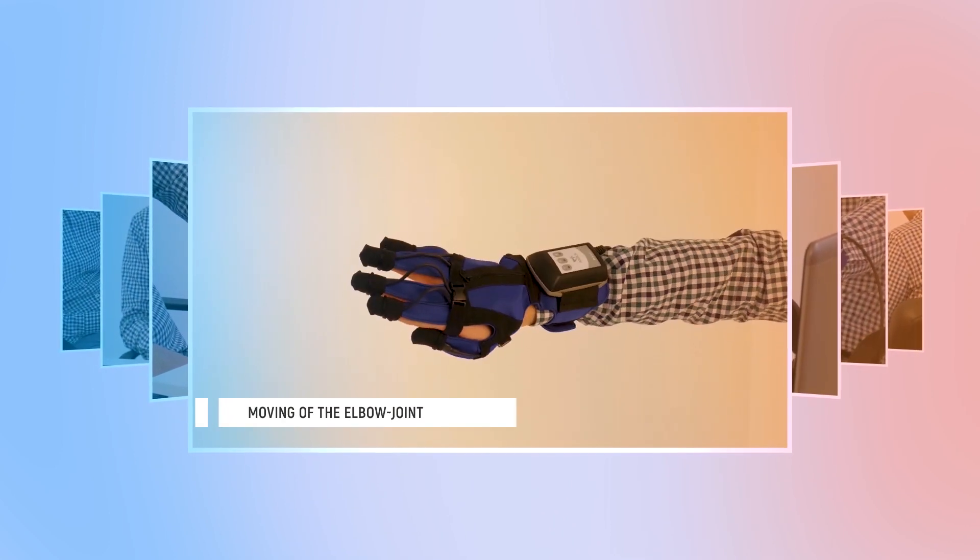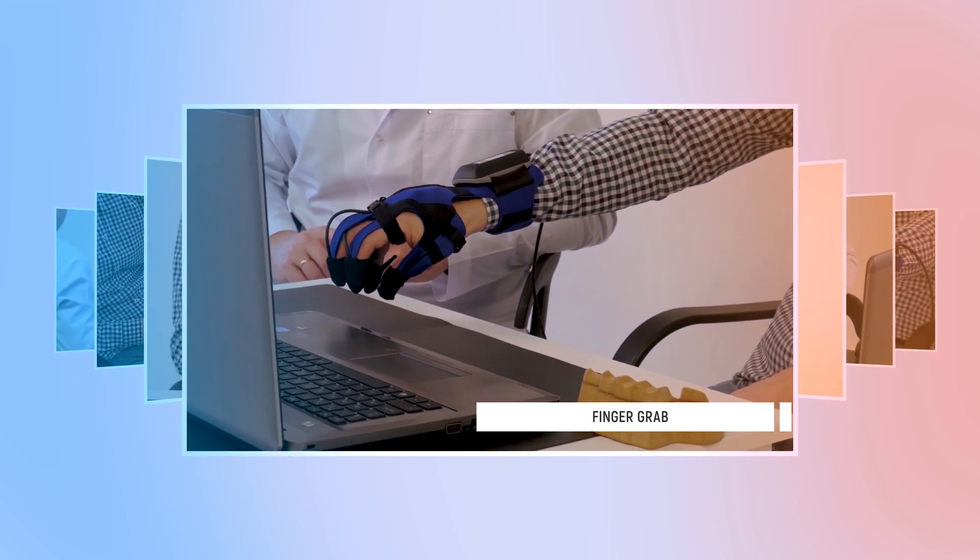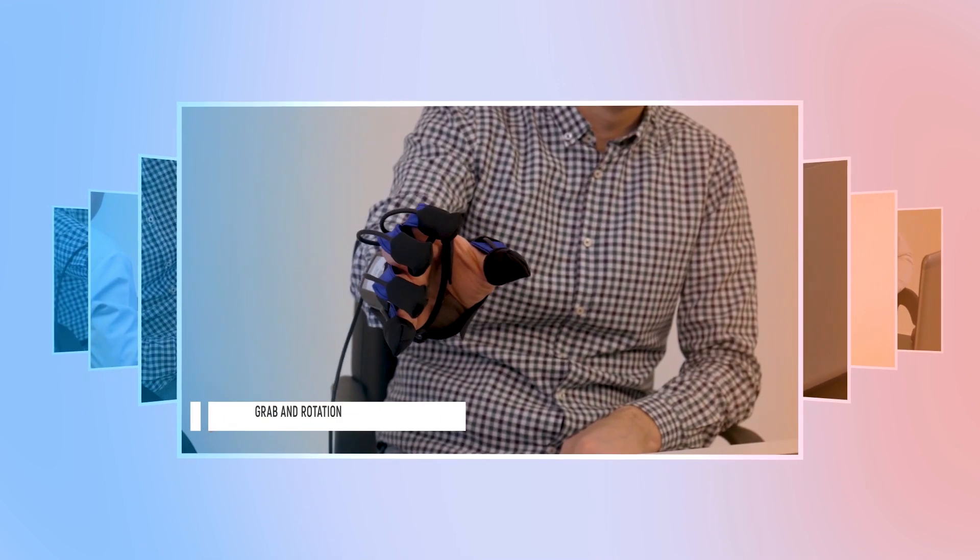The patient can train the movements of the fingers, hand, elbow joint, and various types of grabs.